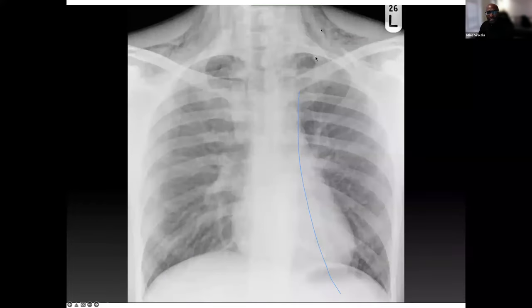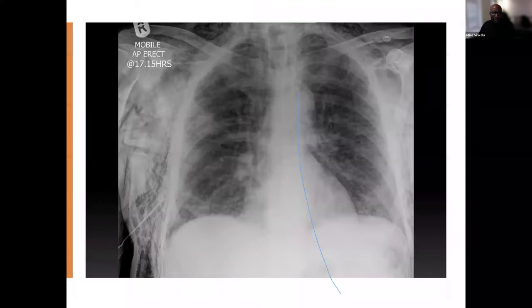Look at this, there is actually diffuse subcutaneous emphysema in this patient. Look at the presence of abnormal air in the subcutaneous tissues bilaterally. So if it is an ICU patient, if patients have had drains put in, they can have these kinds of appearances. Look at this diffuse bilateral subcutaneous emphysema in the axilla and the neck of this patient.